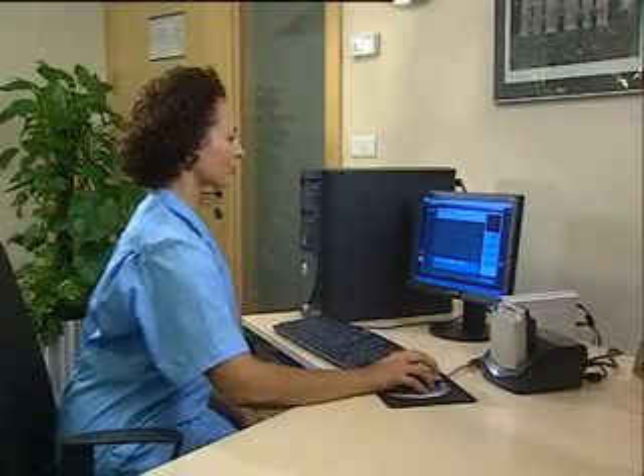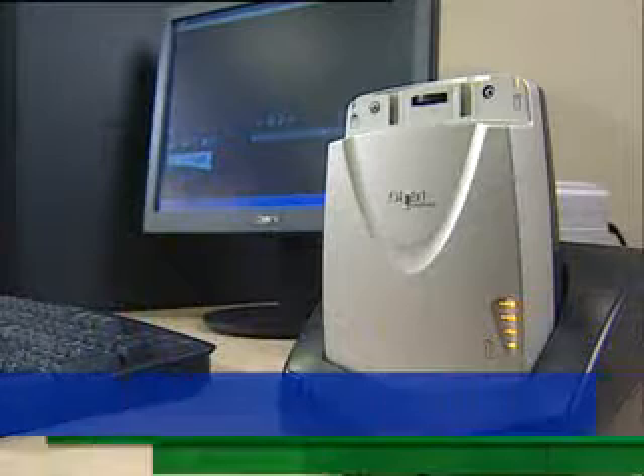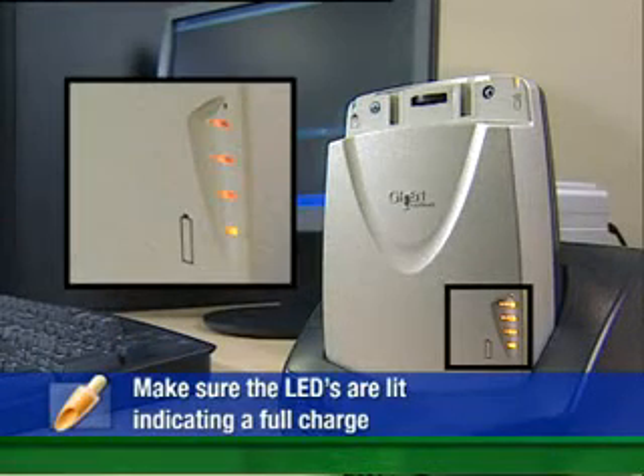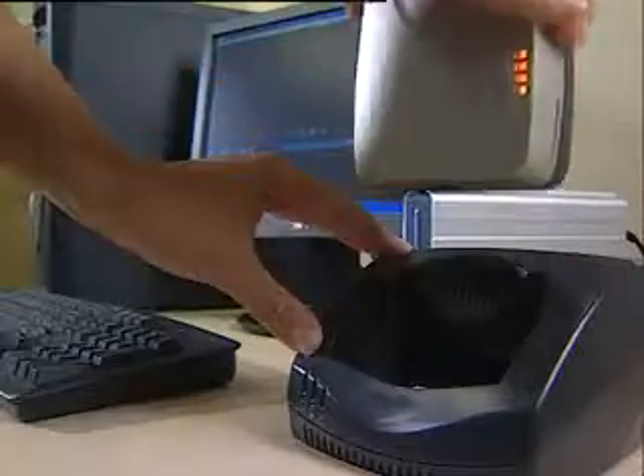Now perform patient check-in to prepare the data recorder for capsule endoscopy. Before you begin, check that all four of the battery LEDs on the data recorder are lit, indicating that the battery is fully charged. In the Rapid application, click the data recorder icon in the upper left corner of the screen, then click Patient Check-in. The Rapid program will guide you through the process of entering patient data. Click Ready and remove the data recorder from its cradle.